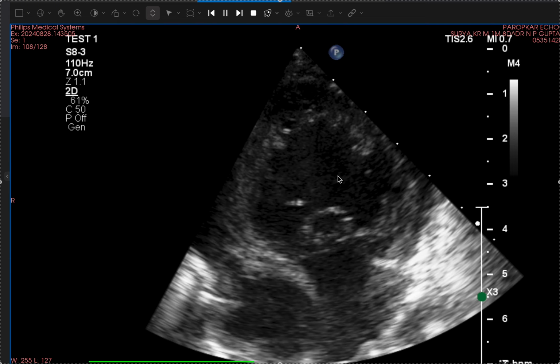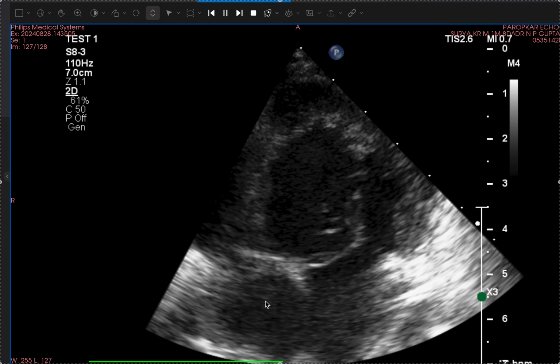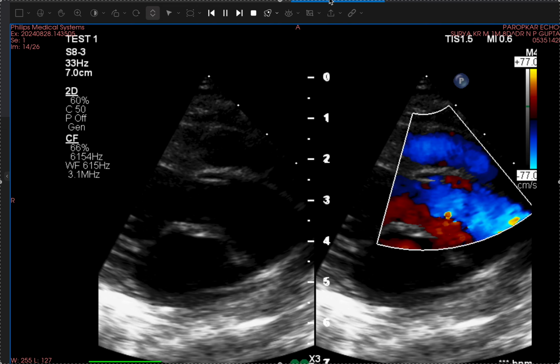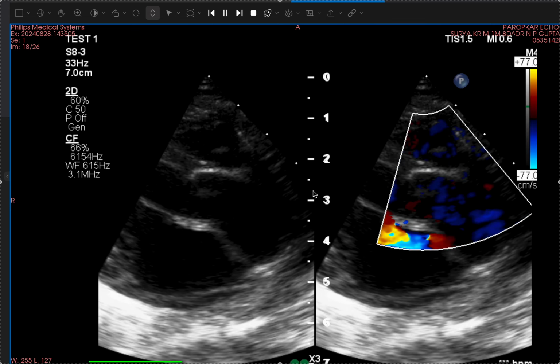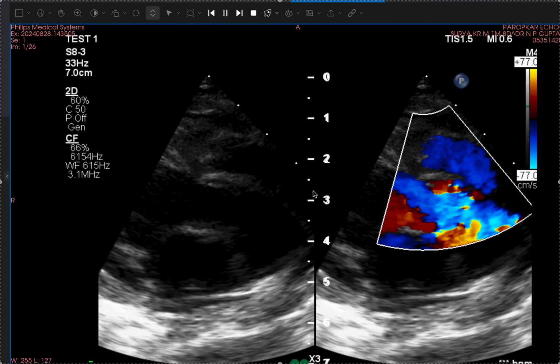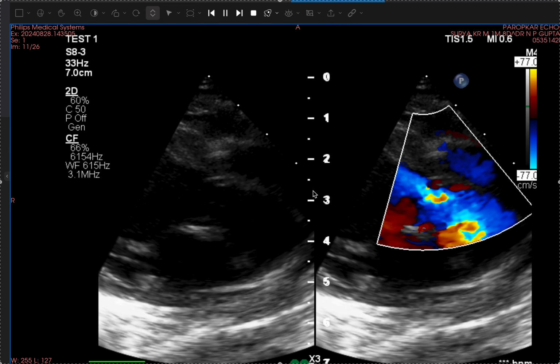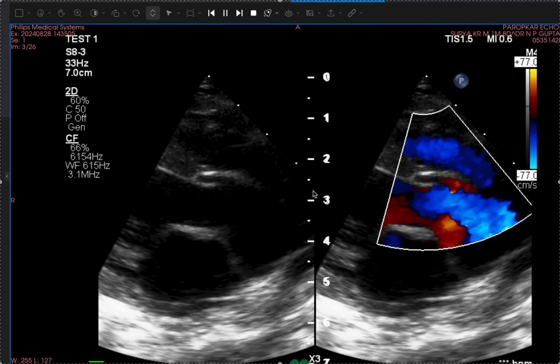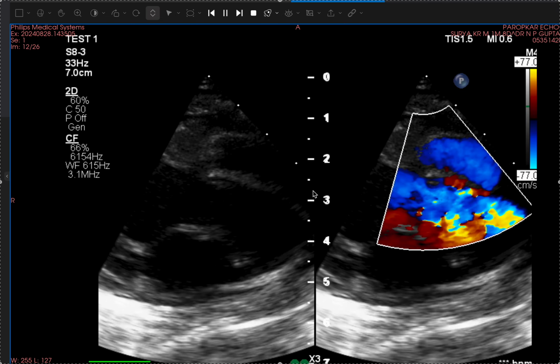This whole is left ventricle, this is left atrium, this is right atrium. So ultimately this case is D transposition of great arteries, inlet VSD, ostium secundum ASD, tricuspid atresia. These are the findings in these cases.